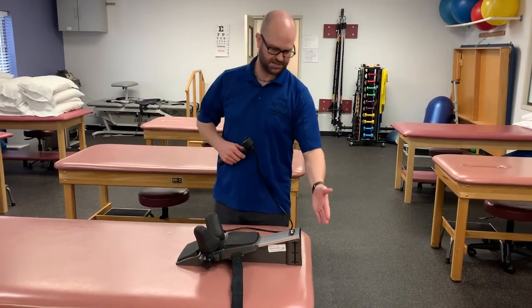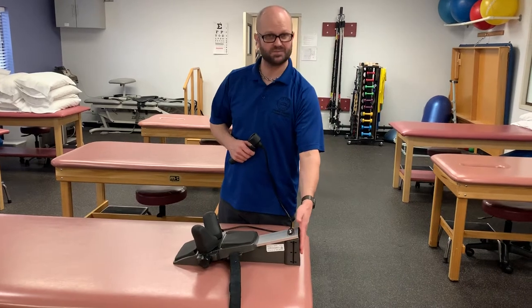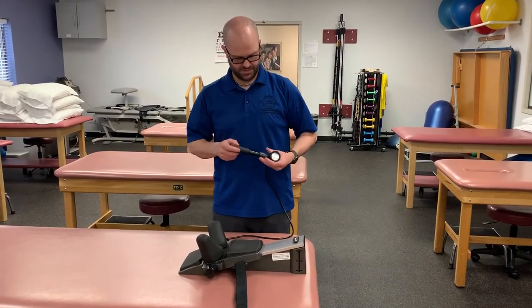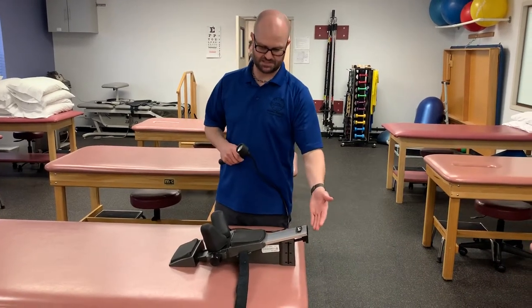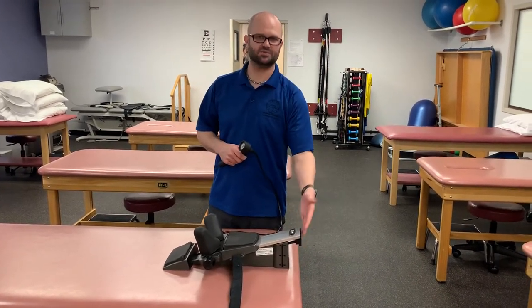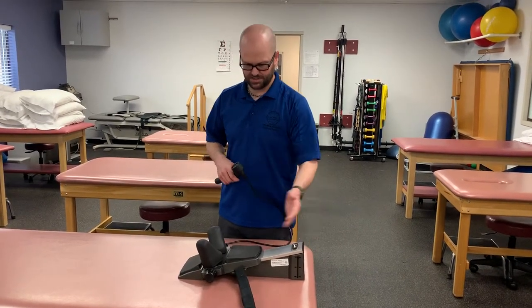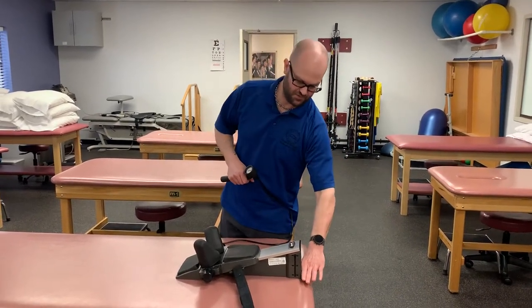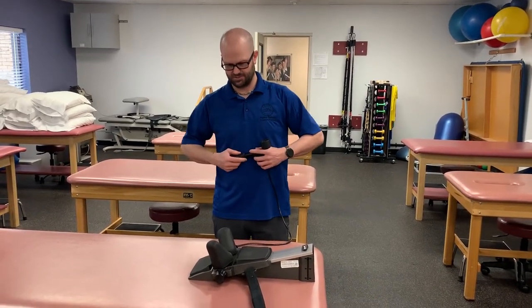Real quick — some people might be tempted to put this up against a wall for support. However, if we start to pump up you'll notice that the entire sled starts to come up, which if it's running into a wall obviously it's not gonna do much. So we do want it to be free of anything it can get stuck on. You can brace it down at the base, but don't put it directly up against the wall or we're not gonna be able to get much out of it.